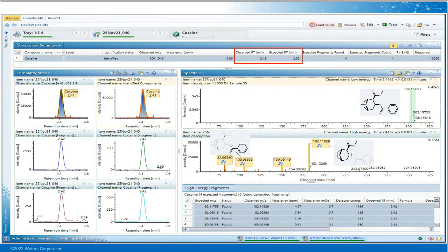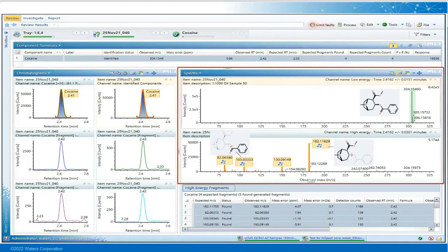The spectral data on the right displays the precursor ion in the top spectra and the corresponding fragment ions in the lower spectra. This is together with the pictorial representations showing the intact precursor molecule and the fragment portion of the molecule that the measured mass relates to.